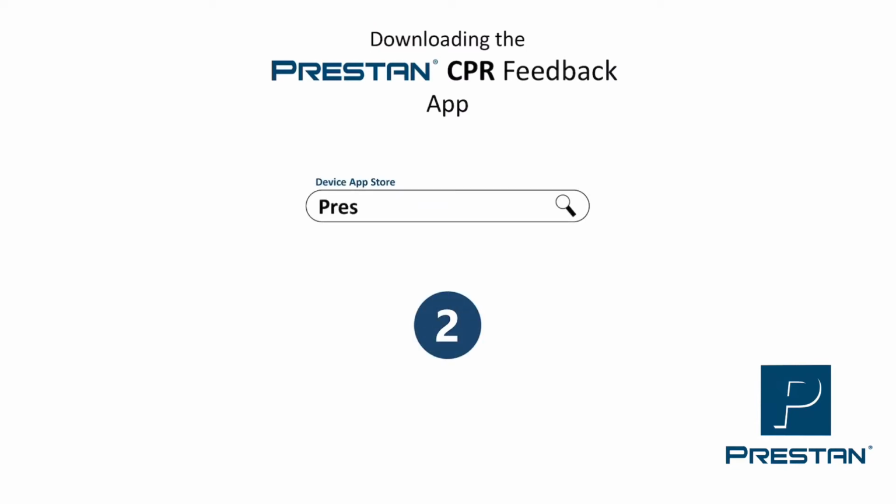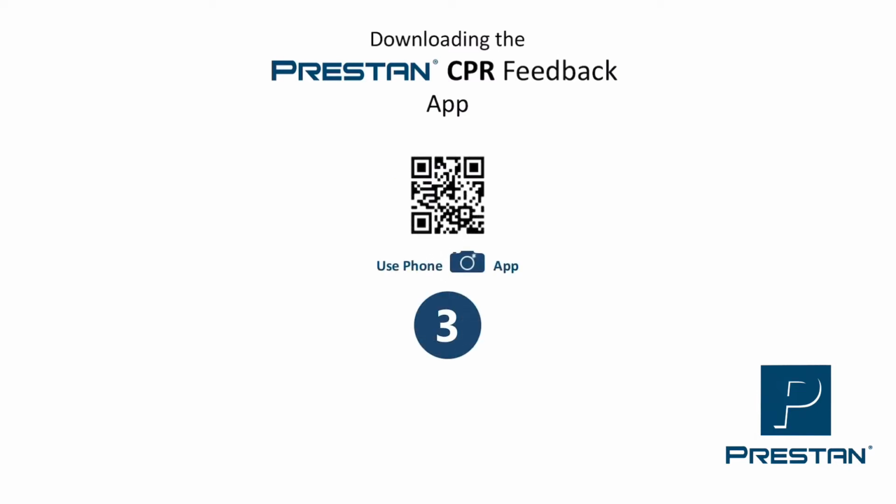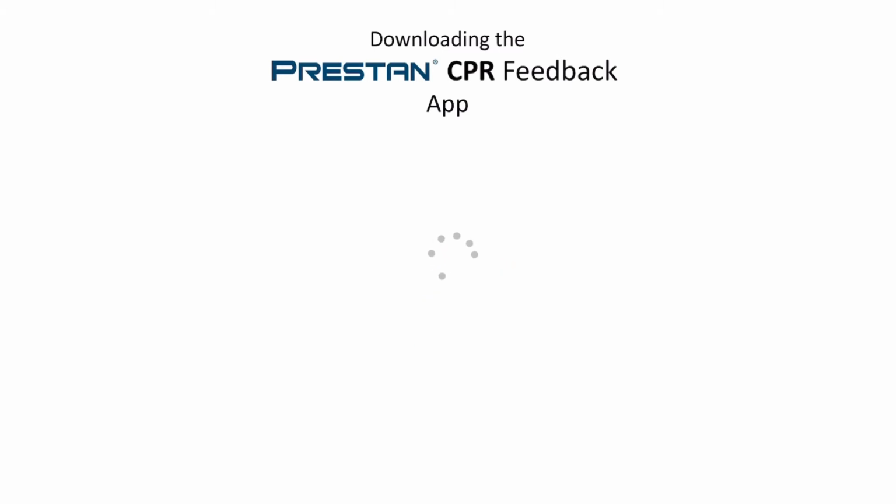Second, you can go directly to the App Store on your smart device and search for PRESTAN CPR feedback. Lastly, you can use the QR code provided at the end of this video. It can also be found in the instruction manual that came with your device.